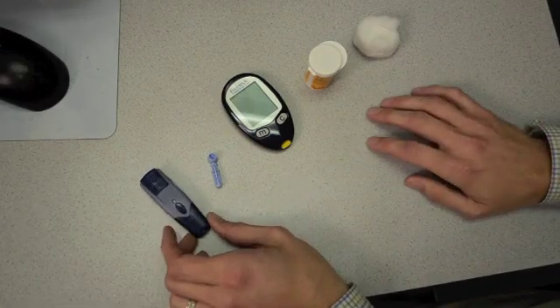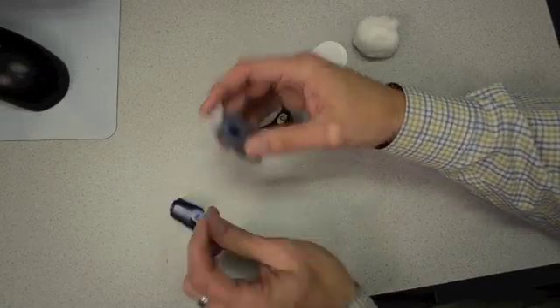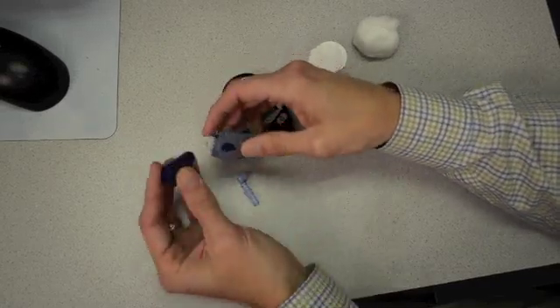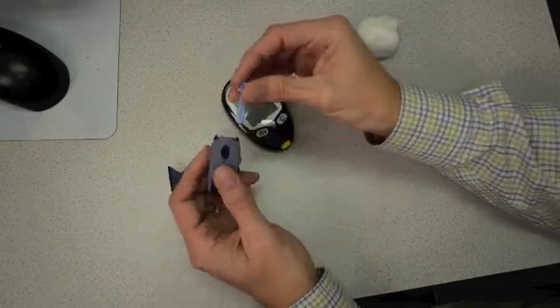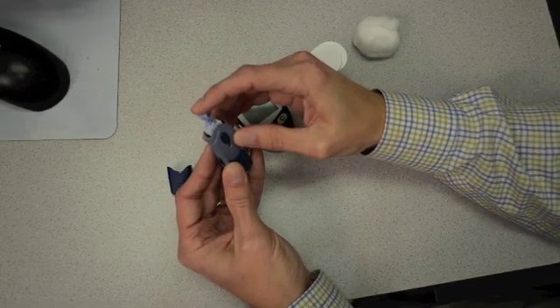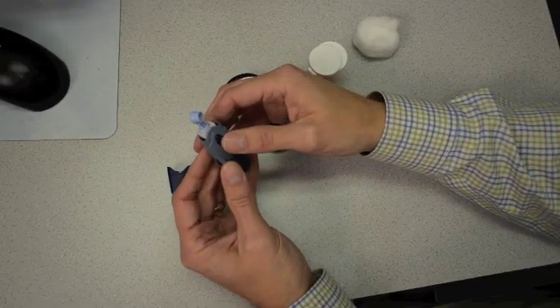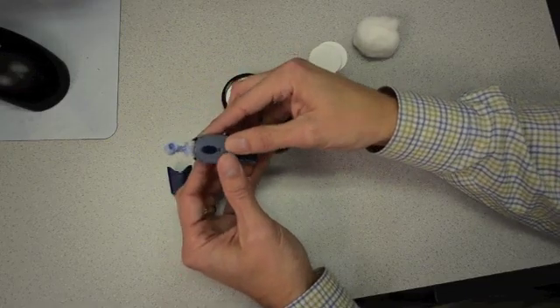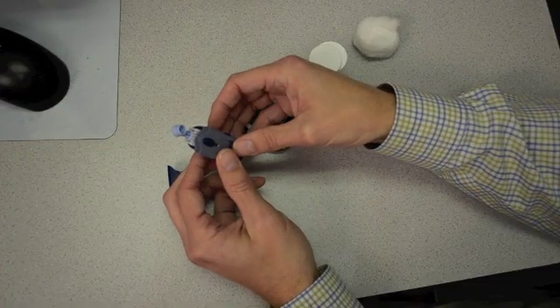After you get everything laid out, the first step is loading your lancing device. Most lancing devices have some sort of cap that you can just pull off very easily. We then put the lancet or needle right in the top. With this particular one, I just push until I can't push anymore and you hear a slight click. If for some reason you accidentally hit the button, it's very easy with this device to just cock it back and that way it's loaded and ready to go.